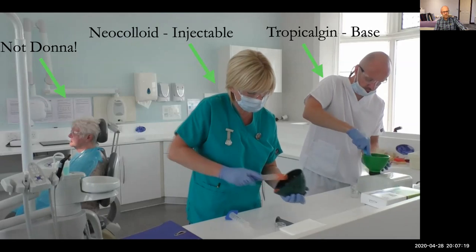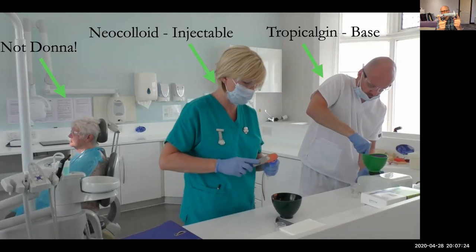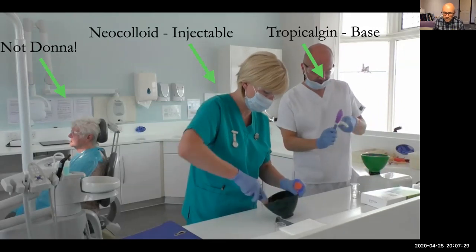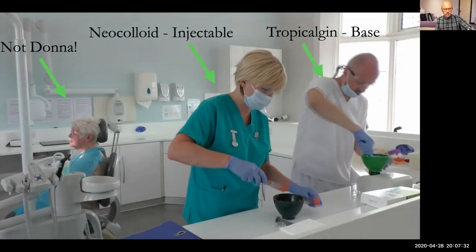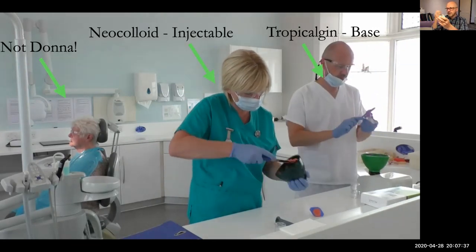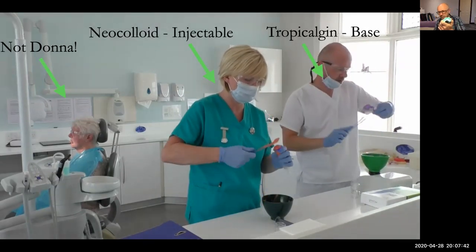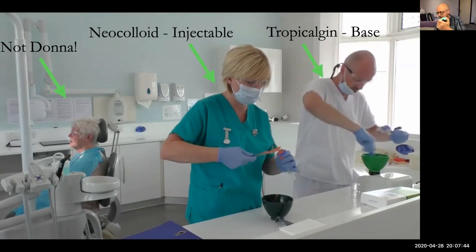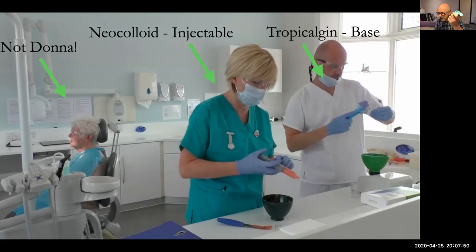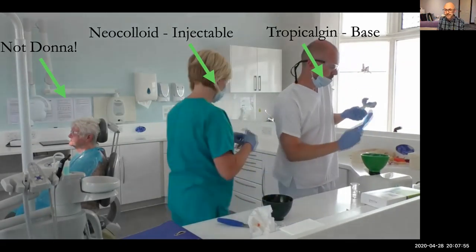And the syringe is a Monoject syringe, a 35 milliliter syringe. You can see it here. And I load my tray. So if you imagine this was an upper tray for Donna, I load that, and I'm thinking about where I want the impression material to go. If we've got a big vault of a palate, I want to get it around the back of the tuberosities. I am really trying to think about a mental map of the whole of the mouth there.